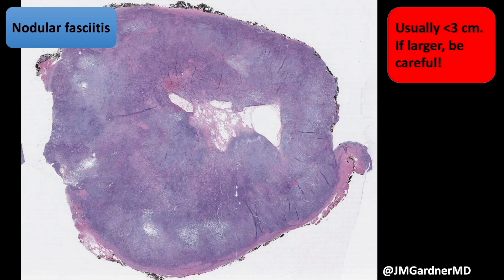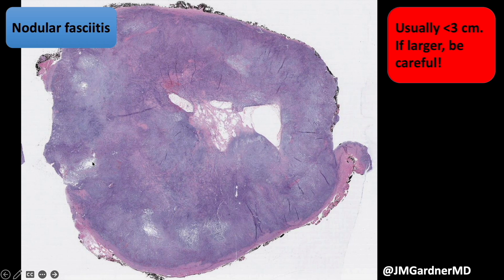Sometimes nodular fasciitis can arise in the dermis with no connection to the fascia — I've seen that before. The other thing beautifully demonstrated here in the middle, and more subtle down at the edges, are these myxoid cystic spaces. Cystic degeneration is common in nodular fasciitis and is an incredibly useful diagnostic clue. It's not always this prominent, but usually you'll find little areas where the tumor cells are starting to fall apart.